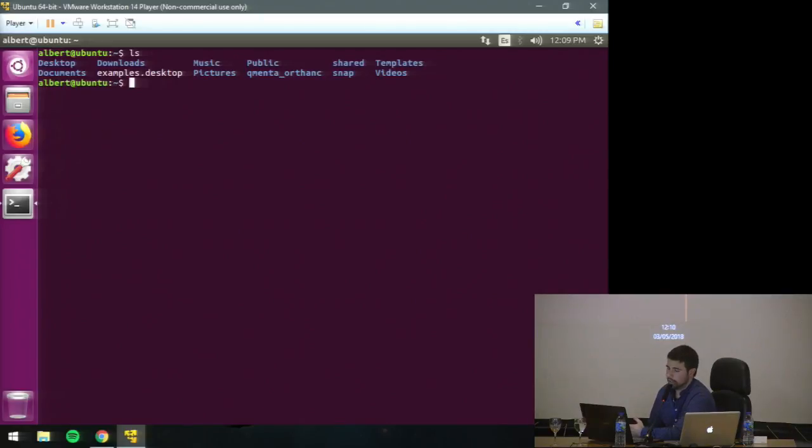It can be really handy if you know a bit how to automate things, because otherwise you will end up repeating a lot of stuff on a typical user interface. And this is something that in time you want to avoid. You want to be as efficient as possible. So the very, very basics of bash include just browsing through the list of commands that you set, which can be done with history.